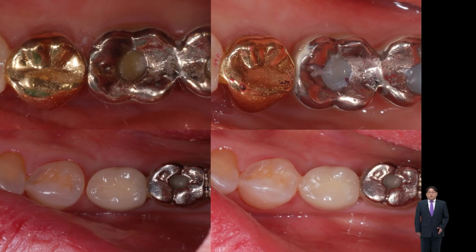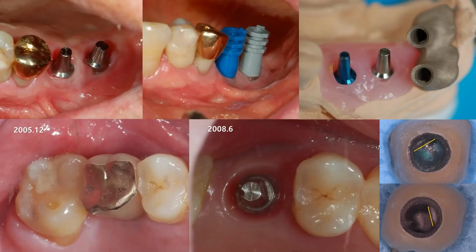In this case, you can build up resin on the adjacent natural tooth. This is not an easy job, both in terms of effort and cost. Retrievability is very important.